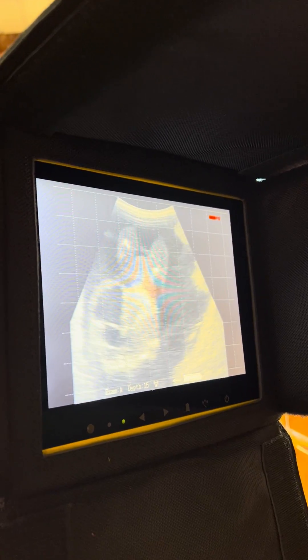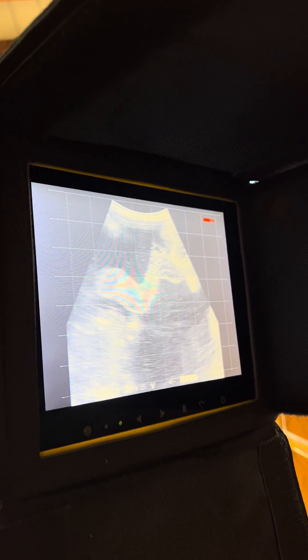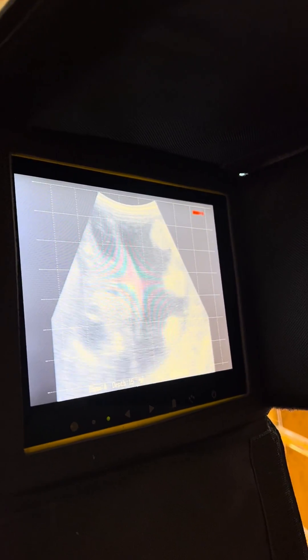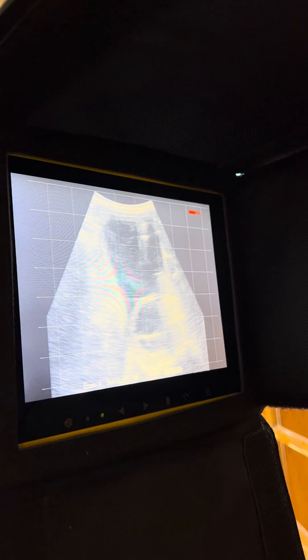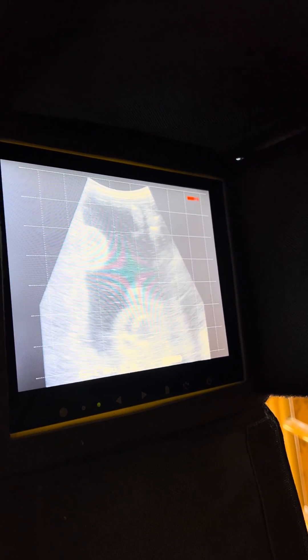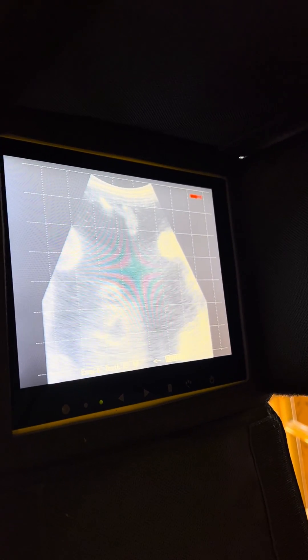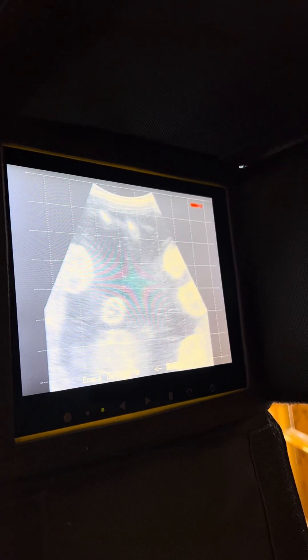Today I want to walk you through the differences on your preset exams with an XTC. We have an XTC direct wired in right now. We're on Exam A, at 15 centimeters deep. This is a great place to start when you don't really know what you're seeing or where you're going with the stage of cattle — just a great general place to begin.